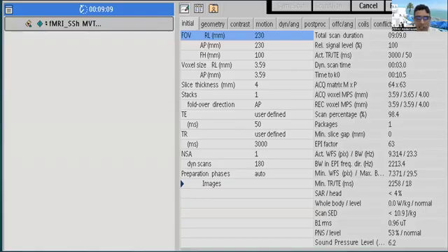Here we used fMRI single shot. The single shot acquisition takes about 15 to 20 milliseconds. There are different parameters for all the radiologists or technicians that use Philips machines. Try to use the FOV of a basic brain, and use a short TE to minimize the T2 effect, with the orientation as is.